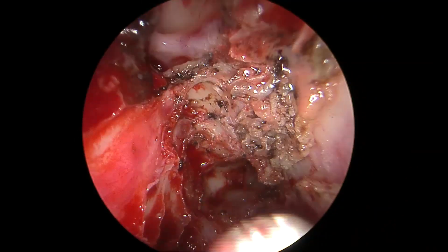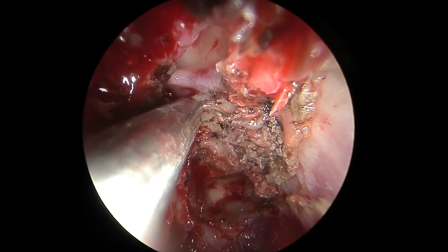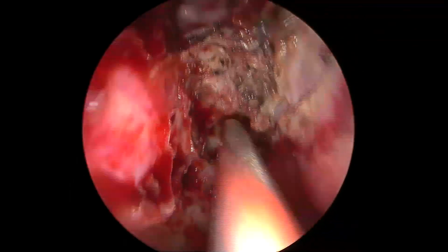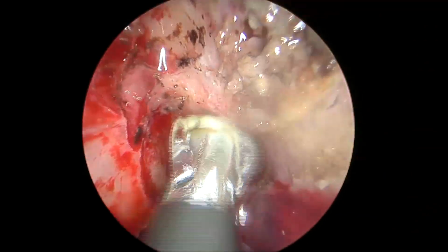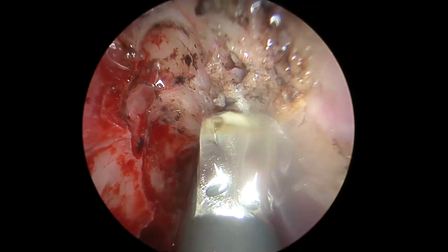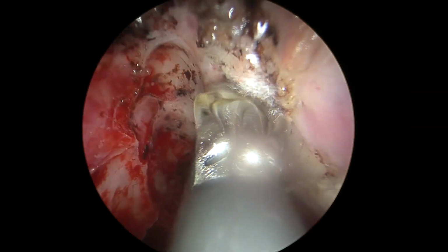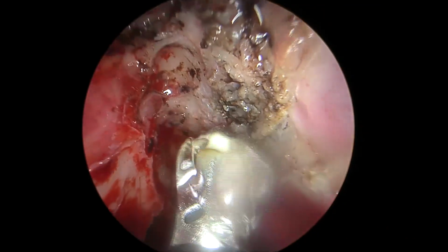Some of the team members have already harvested the fat graft and the fascia. The mucosa has been taken off the middle turbinate. You can see the anterior ethmoidal artery now very well visible. In this particular situation, since our defect was well behind the anterior ethmoidal artery, we did not need to do anything to it. Sometimes, in an anterior-based defect, the anterior ethmoidal artery needs to be coagulated and taken down for our bone to be flattened and for us to place a graft nicely and neatly.